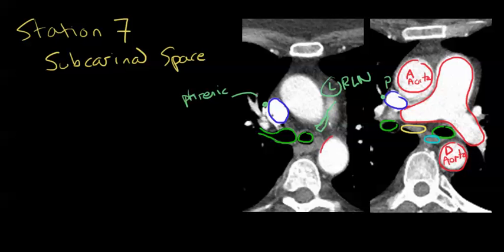You've got descending aorta and ascending aorta. Right about here you can see your mammaries — here's your right mammary and here's your left mammary. And, of course, the sternum here, and on the backside is going to be the spine.